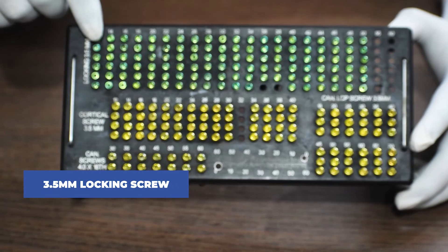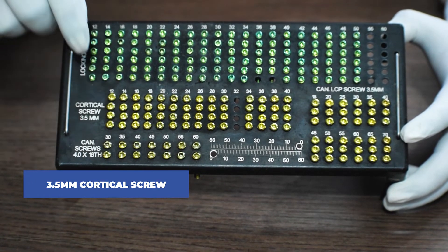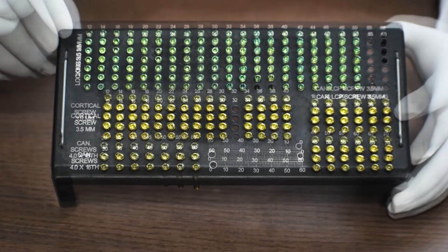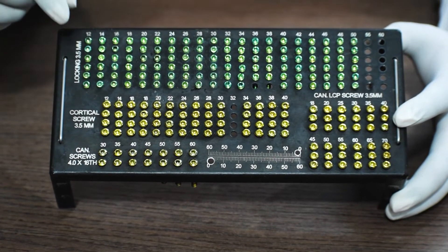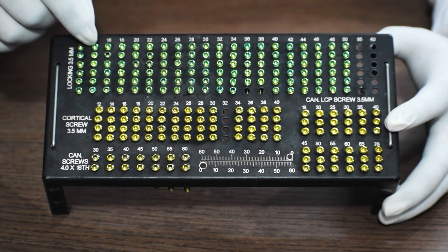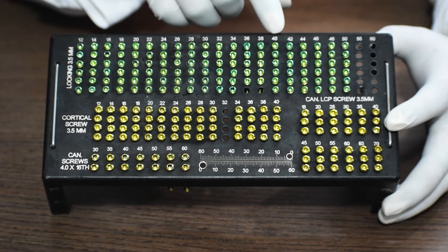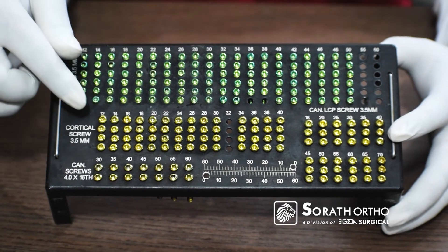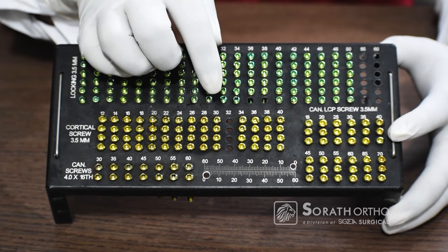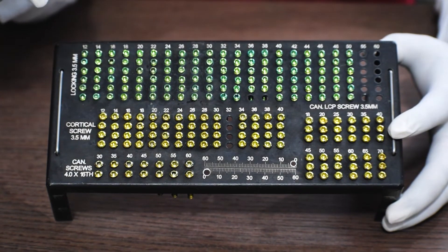Coming down to the screws: we start with 3.5 mm locking screws, then 3.5 mm cortical screws, and 3.5 mm full-thread cancellous screws. Available sizes: for 12 mm screws, six pieces are provided; from 14 mm to 22 mm, twelve pieces each; from 24 mm to 26 mm screws, six pieces each. For cortical screws it's the same — six pieces of 12 mm, twelve pieces each from 14 mm to 22 mm, and six pieces each from 24 mm to 26 mm.